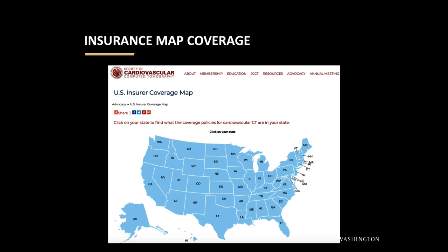Yeah, that was a really great summary. So, one could think of SCOT-HEART not as a test of coronary CT, but as a test of the value of disrupting clinical inertia, which is the tendency to keep treating patients the same way you've always treated them and not think that maybe we should approach them differently. Have the data been looked at with that in mind? In other words, the patients who eventually got switched over to more intensive medical therapy, if they were looked at more critically, would they have been switched over anyway based on clinical criteria?